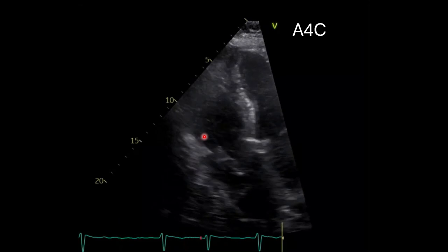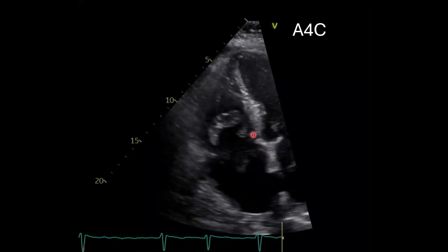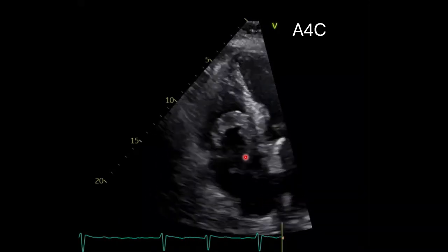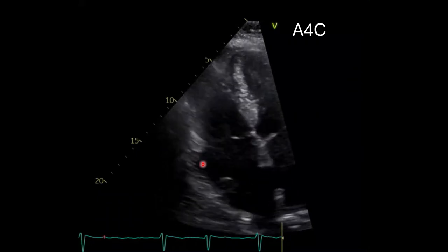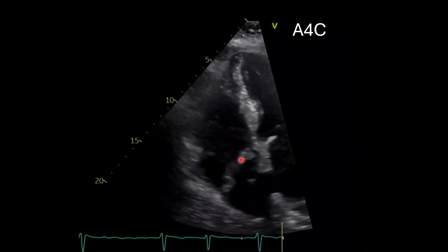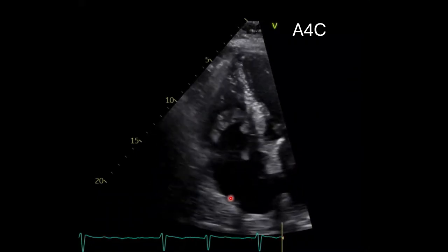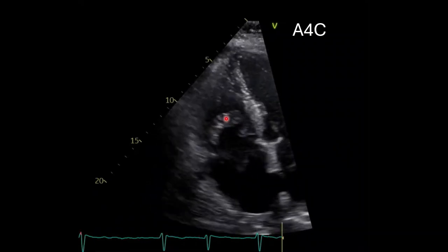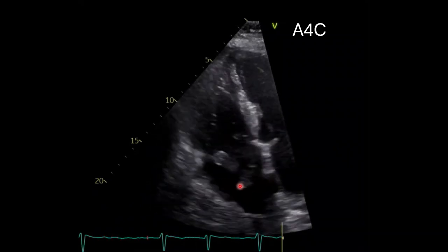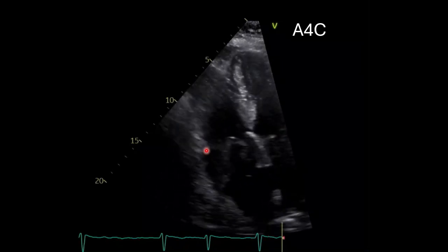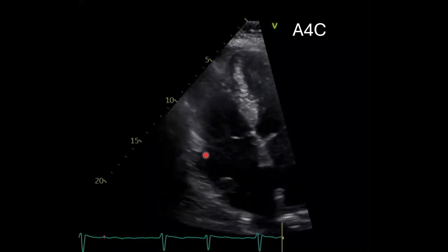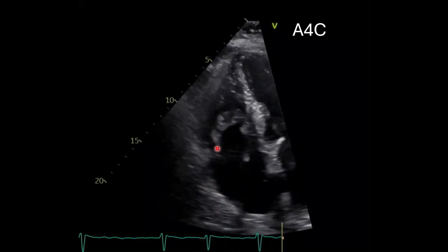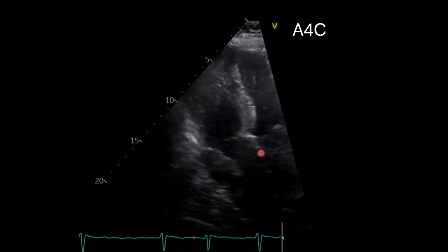Now if we move to the apical four-chamber view — this is an RV-focused apical four-chamber view — you'll notice again there's an echogenic mass in the right atrium that essentially prolapses into the right ventricle and then moves back to the right atrium. Again, it doesn't appear to be attached to the valves here or to the interatrial septum.